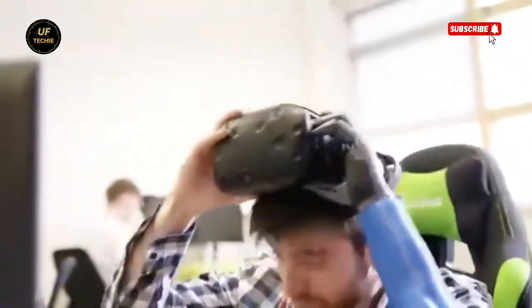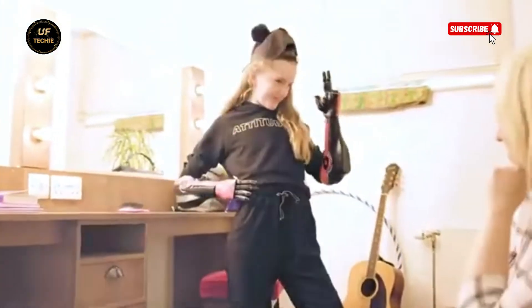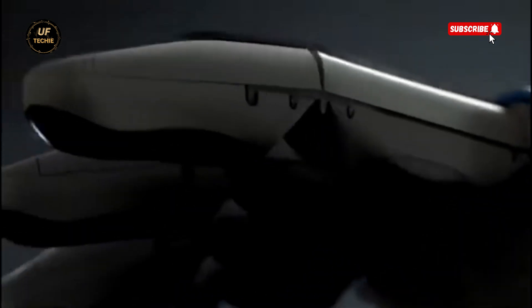Open Bionics Hero Arm. Imagine having a superhero arm, one that looks futuristic and gives you back control of your life. That's exactly what the Open Bionics Hero Arm does. It's not just a prosthetic — it's a lightweight, advanced, and highly functional bionic arm designed for people with below-elbow limb differences.